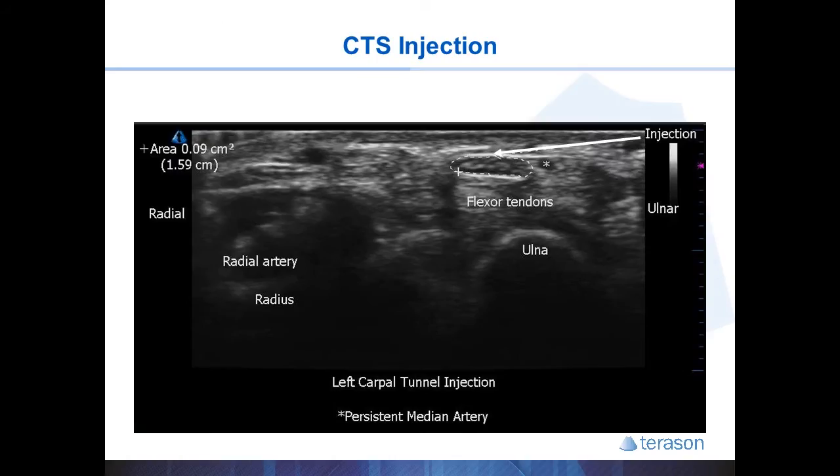In this image, the median nerve is brought close to the side where the needle is coming from, and the ulnar artery is no longer seen on the screen. In this example, the asterisk shows a patient with a persistent median artery, which you would want to avoid.